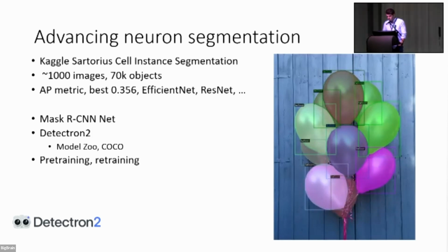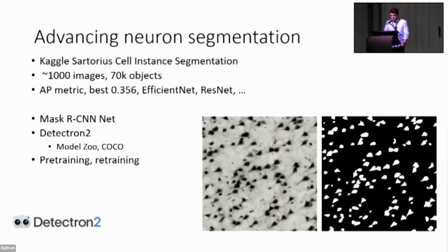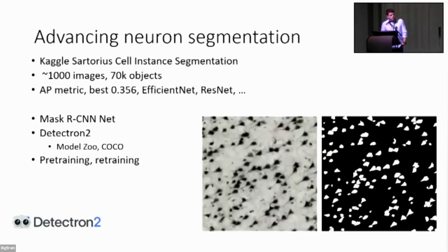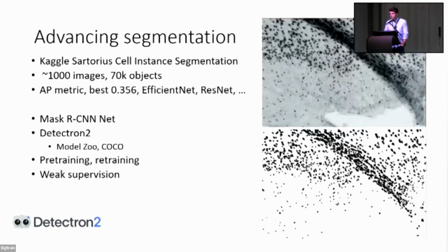So of course we will do it on a neurons dataset, because we have a lot of these masks from our previous research, right? So that's one thing to do, and it's kind of a weak supervision, right? So you don't really have exact segmentations that you need really very many for these deep learning systems to work. And so we'll see how this turns out.